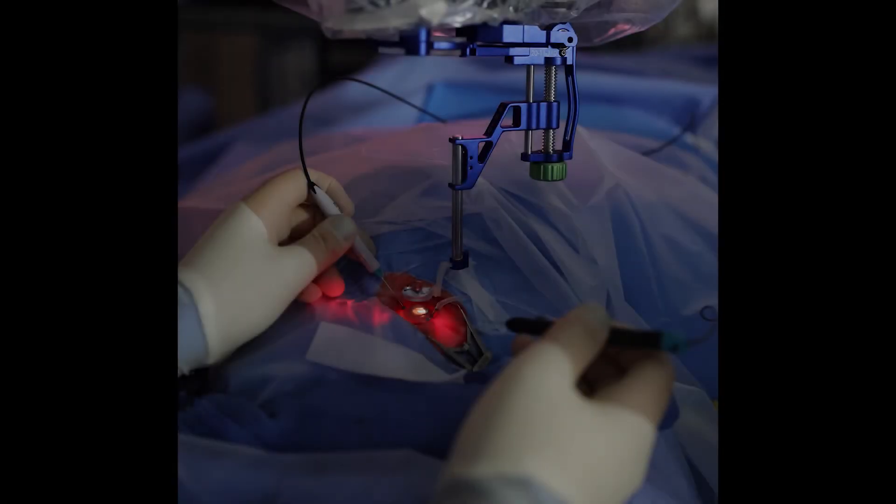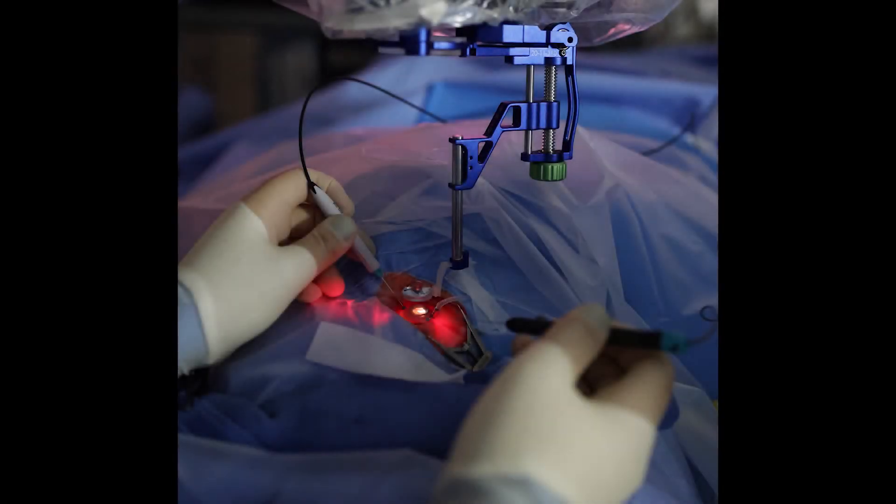The second thing that makes it very versatile is that the focus throw has a much longer throw on it. You can adjust focus and achieve focus whether you have a condensing lens on your microscope that's either 175 millimeters or 200 millimeters.